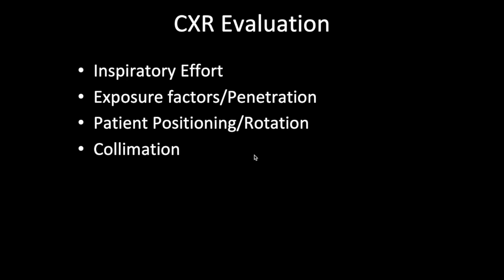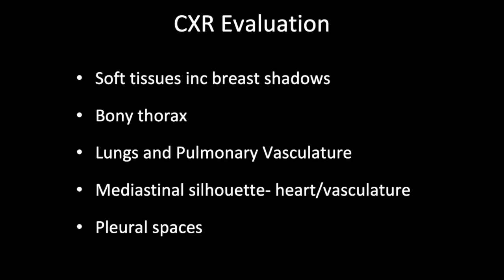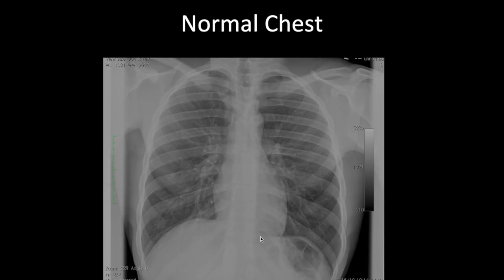I'm going to focus right now on how to evaluate the normal chest. So this is a normal chest radiograph. When you're evaluating any radiograph or any imaging test, you need to treat it like an experiment. You need to first determine whether or not the image is of diagnostic quality in the patient of interest. The first thing you need to do is identify the patient. This image is anonymized for teaching purposes, but there will be a name plate or identification marker on the film indicating the patient's name, their age, and registration number.